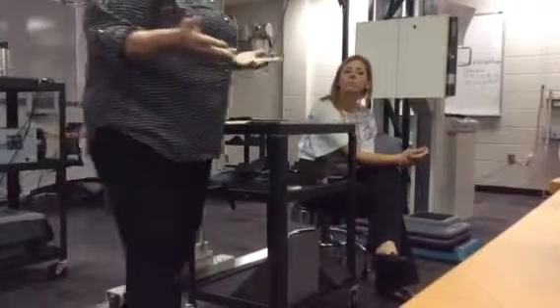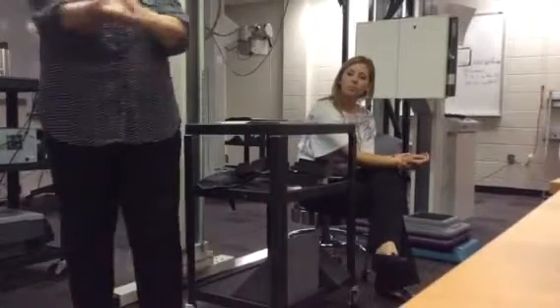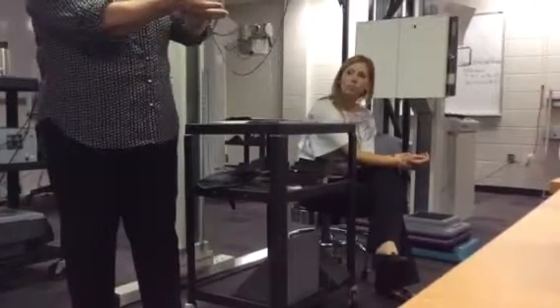So if your patient comes in with an injury or a complaint of pain or whatever reason you're x-raying that patient, and it's closer to the wrist, then you want to include the distal radius and ulna. If it's closer to the elbow, you want to include the proximal radius and ulna.